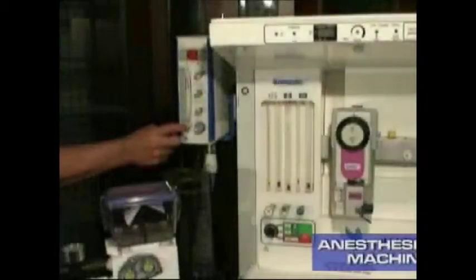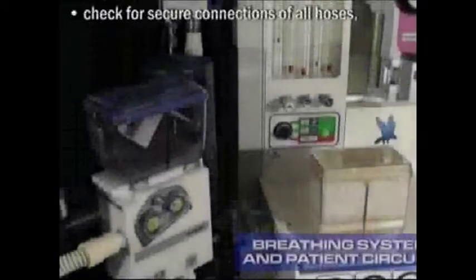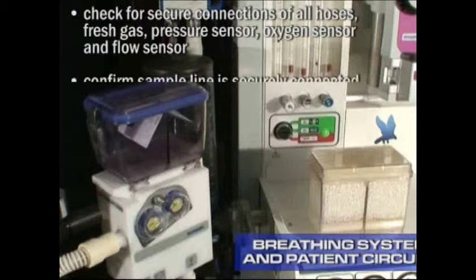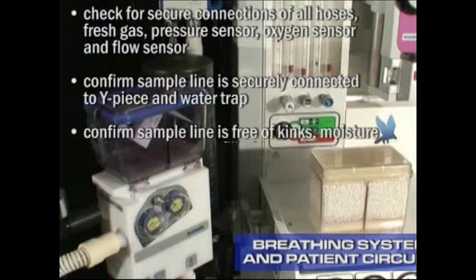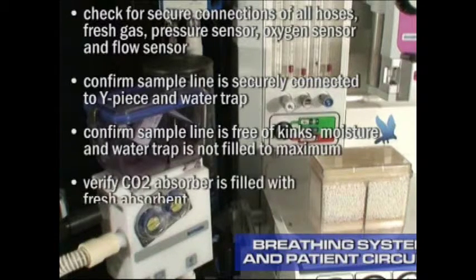Turn on anesthesia machine. If applicable, follow system and ventilator self-test. Check for secure connections of all hoses, fresh gas, pressure sensor, oxygen sensor, and flow sensor. Confirm sample line is securely connected to Y-piece and water trap. Confirm sample line is free of kinks, moisture, and water trap is not filled to maximum. Verify carbon dioxide absorber is filled with fresh absorbent.